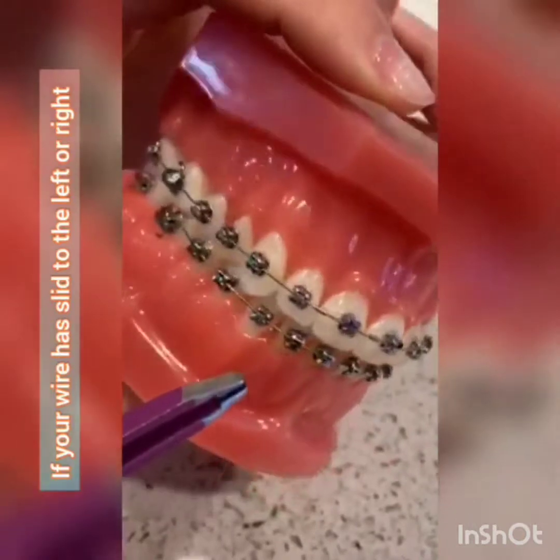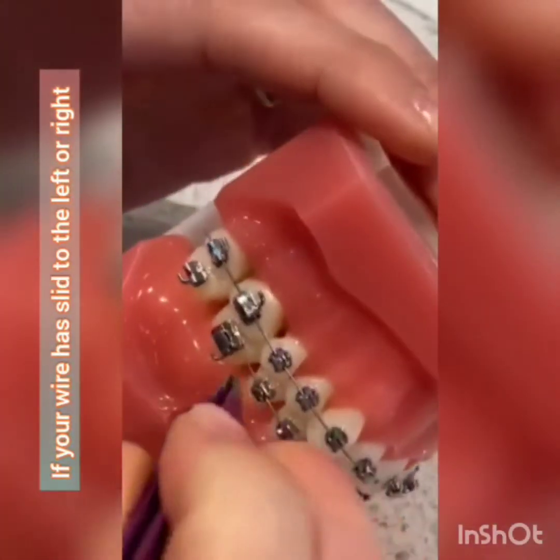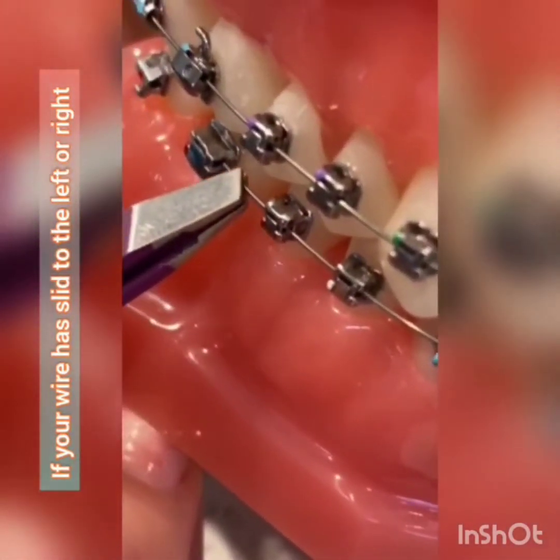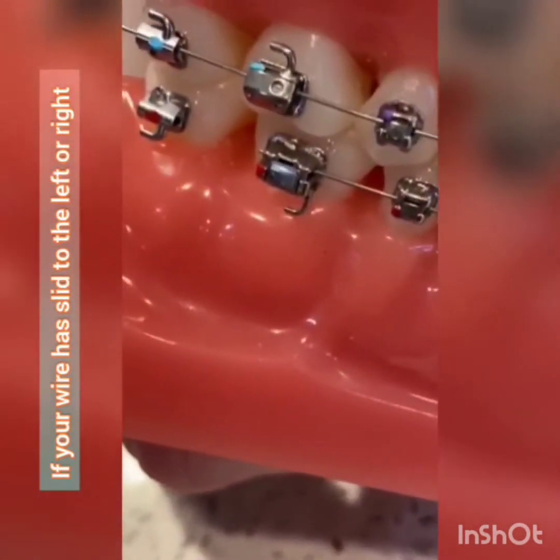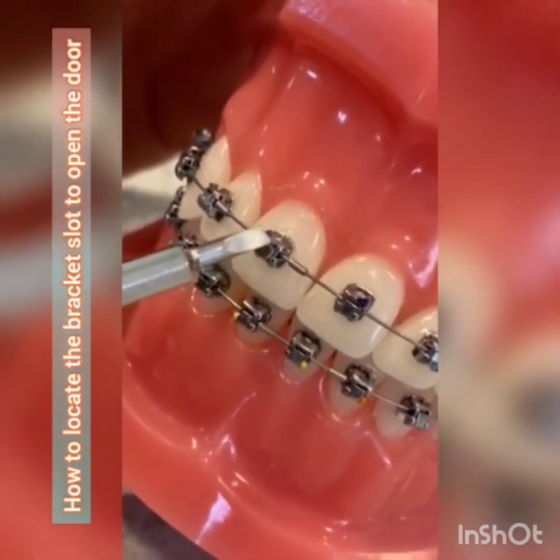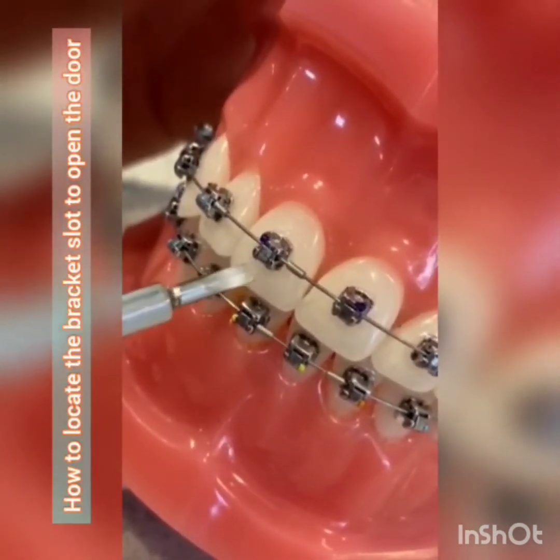Another problem that you might have, similar to this, is that your wire is short over here. You're going to take your tweezers and put it back in that hole. You might need a flashlight in order to see what you're doing back there, like so. Alright, so on each bracket you are going to see this little slit where the wire runs through the bracket. On the top and the bottom, you are going to be pressing down in that slit to let the wire free.